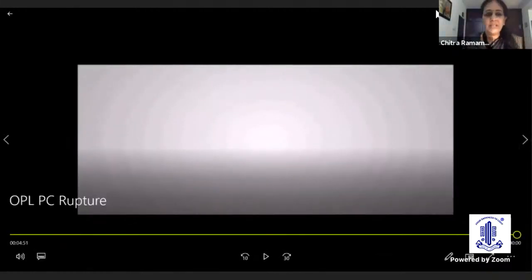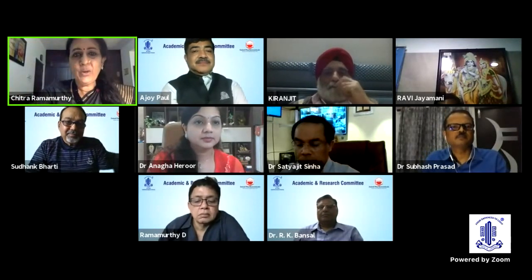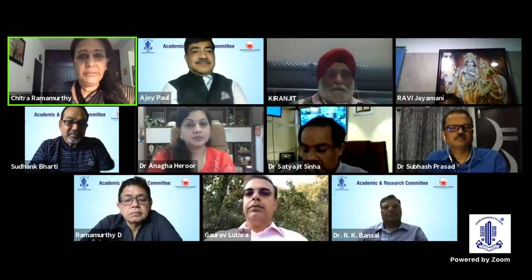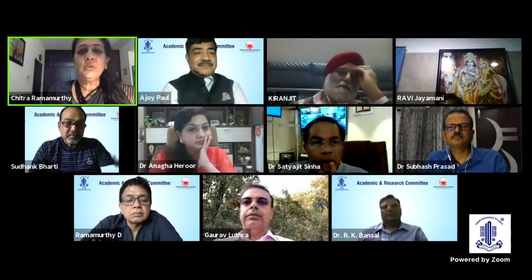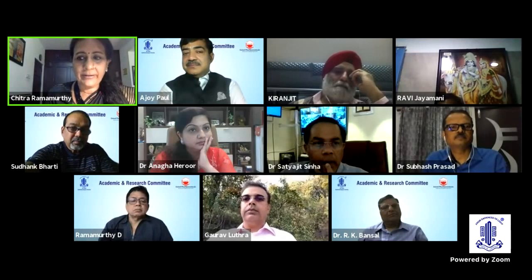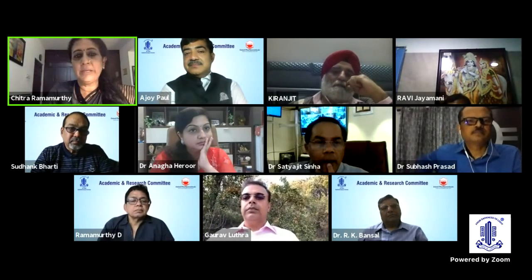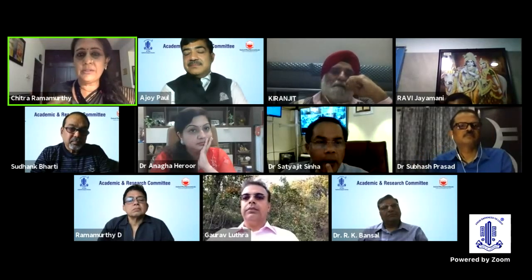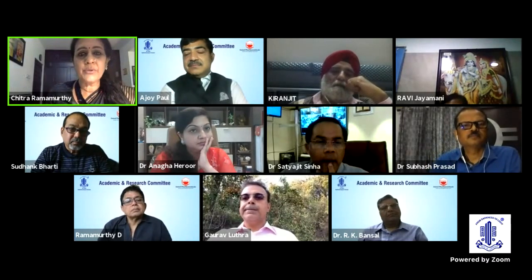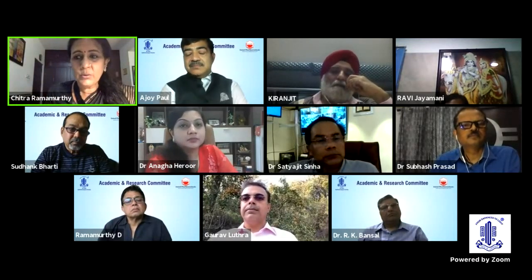Thank you, Dr. Bharti. That was a lovely teaching video, and we'll be seeing different polar cataracts, but there is always a different tip to learn each time. Having seen your videos, you brought about this talk about creating a PCC in a posterior polar cataract. Now, we all know that the posterior capsule is going to be thinner, 4 to 6 micron, and more elastic than an anterior capsule, which is about 14 to 16 microns. More so in a polar cataract, the posterior capsule is actually supposed to be quite ready to split vertically rather than its usual round.